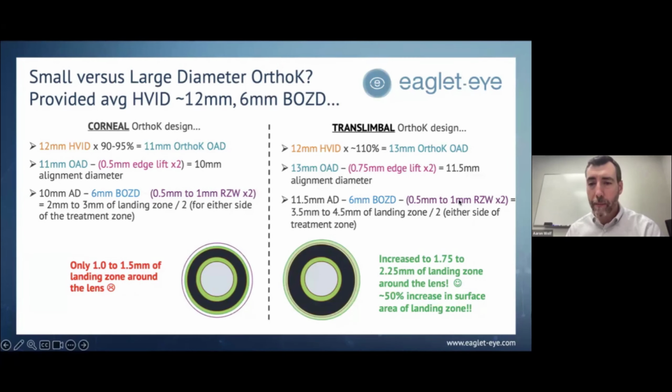So you do still want the edge of the lens to depart from the cornea before that limbus. I usually describe that more like an airplane on a runway. If you have a longer runway versus a shorter runway, it seems beneficial. You may not need a longer runway, but you certainly don't want a short runway. And if you do have a longer runway, you can use as much as you want of it, as long as you take off before the runway ends. It's the same thing with these lenses. You're going to want that lens to depart from the cornea just shy of that limbus.